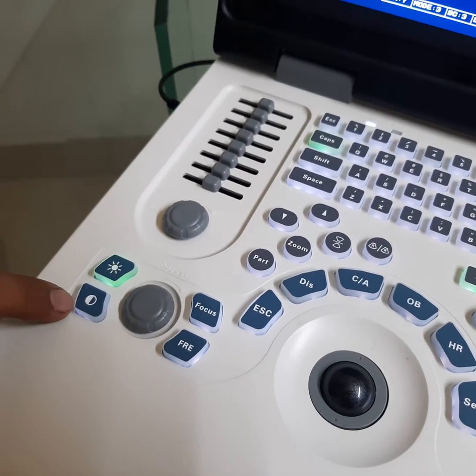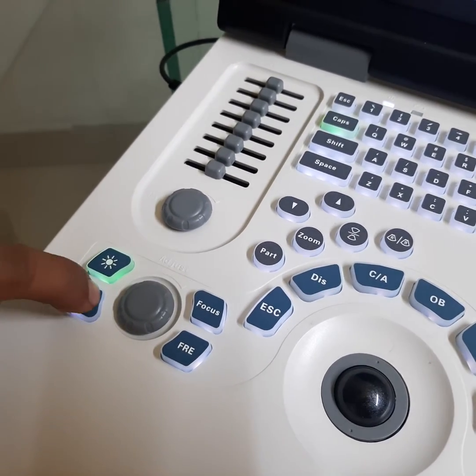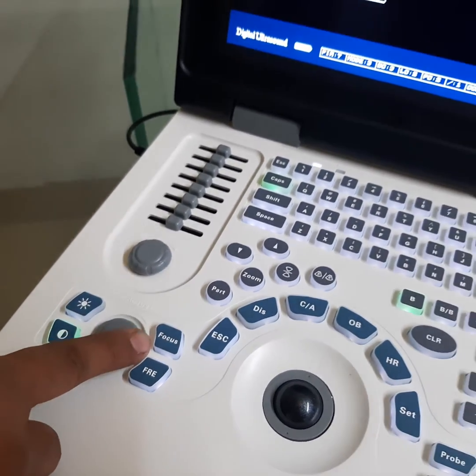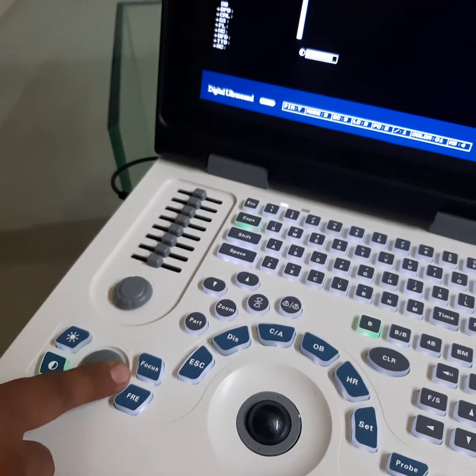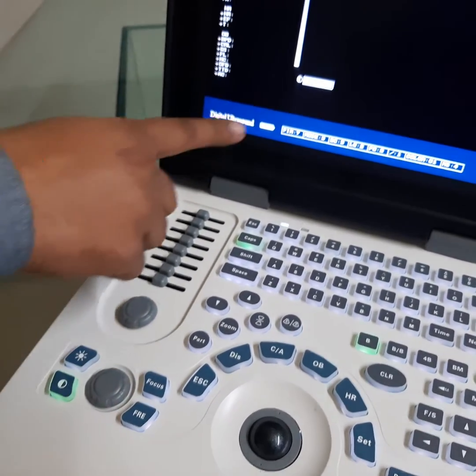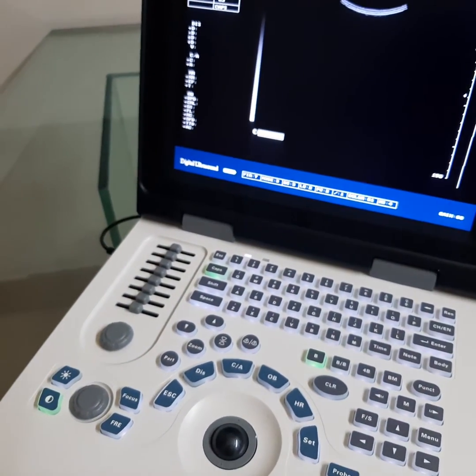This button for contrast. Press this button and adjust right and left for increasing and decreasing the value of contrast of overall display.